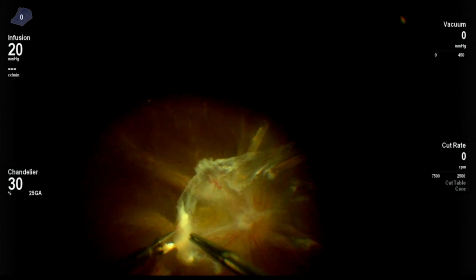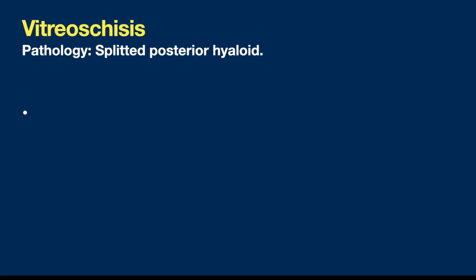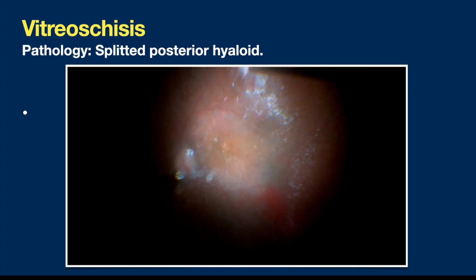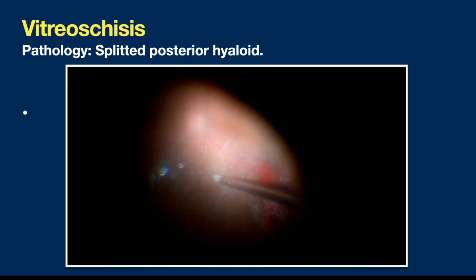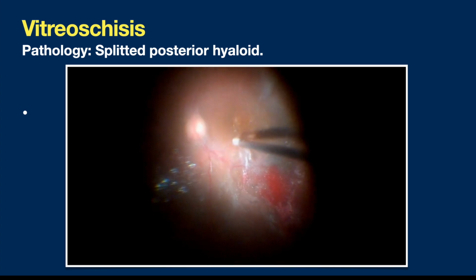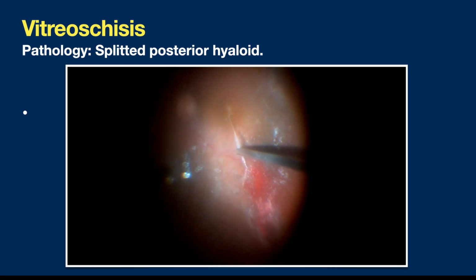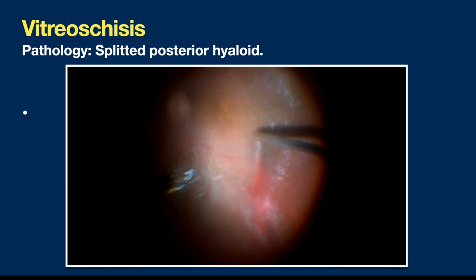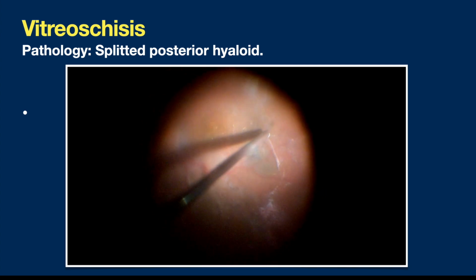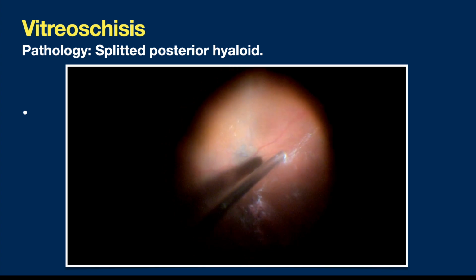We have to beware of vitreoschisis. And vitreoschisis is the split posterior hyaloid, like in this case where the posterior hyaloid here is very adherent, in this case of a simple hemorrhage, and this hyaloid is adherent on the retina, where if it's left, it can cause contraction after doing PRP and may open laser scars and may cause a detachment. So it's very important to stain with triamcinolone.